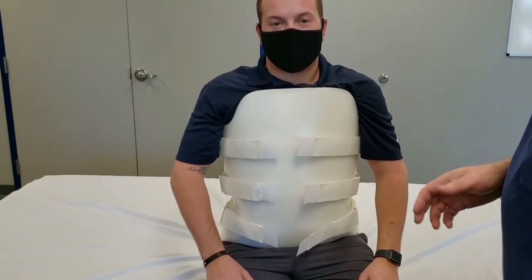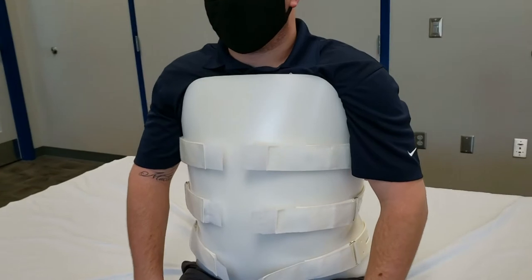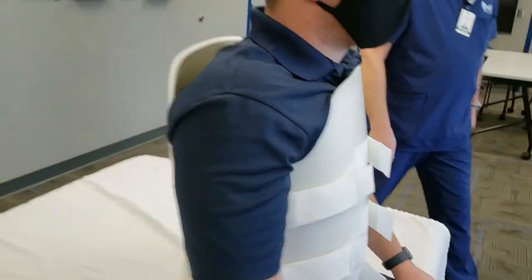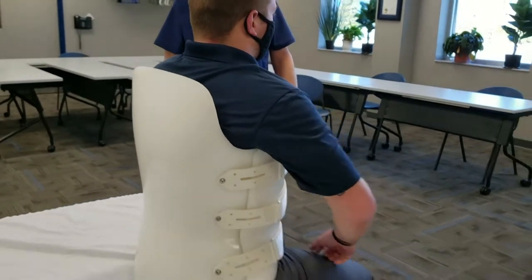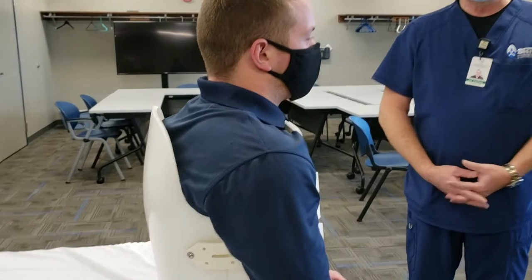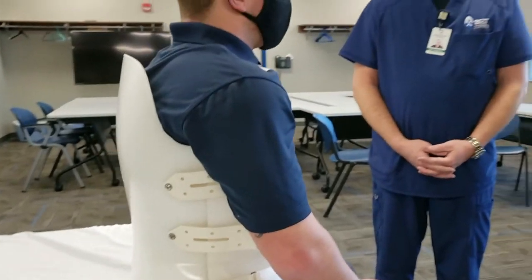We'll take the brace and make the adjustments that are required. But all in all, that's a good first fitting for him — everything looks well positioned and tightened in place. We would tell the patient to wear a t-shirt or undershirt under it. In the hospital, typically they're wearing their gown, which is just what has to be because of IVs and other things.